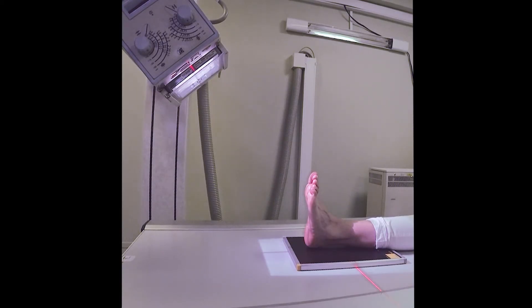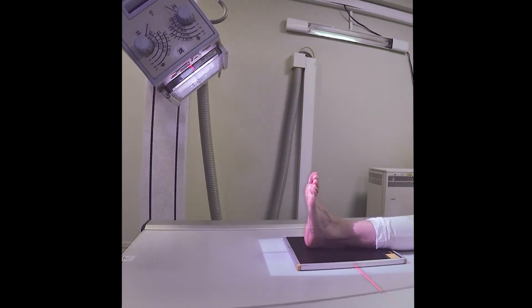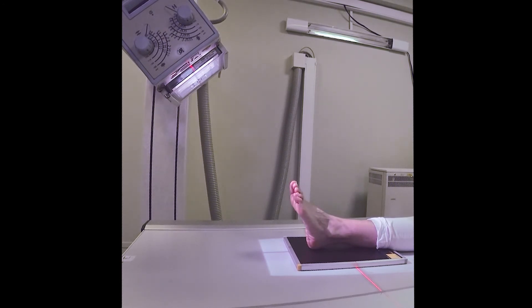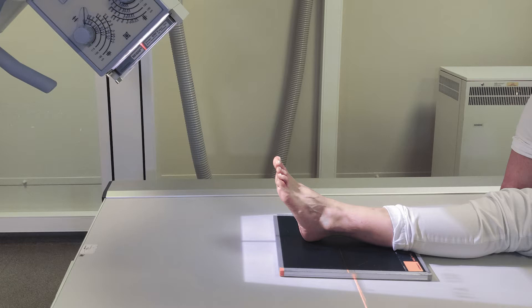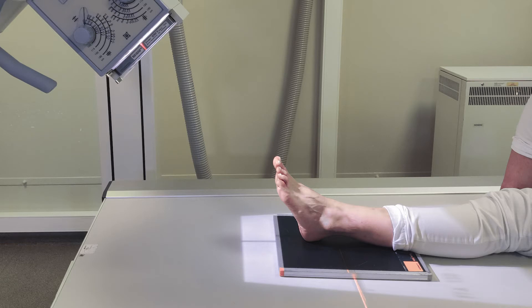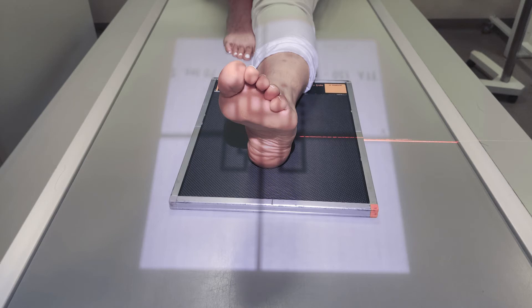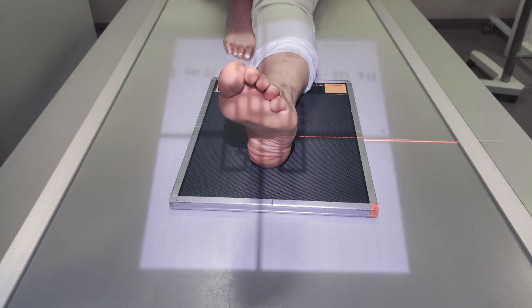The most common defect of this procedure is plantar flexion of the foot. In such cases, only the calcaneal tuber can be observed. The subtalar joint and sustentaculum tali are not presented on the film. Sometimes it is impossible for the patient to flex the foot correctly due to pain.